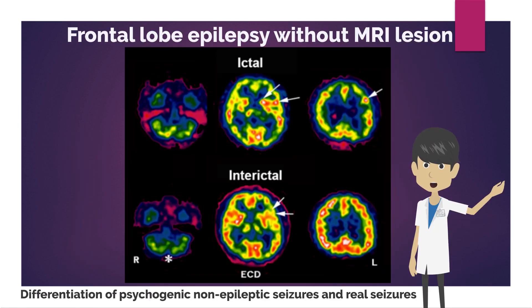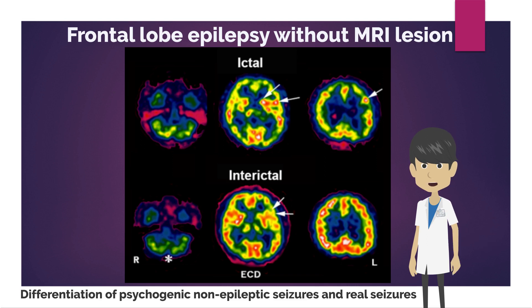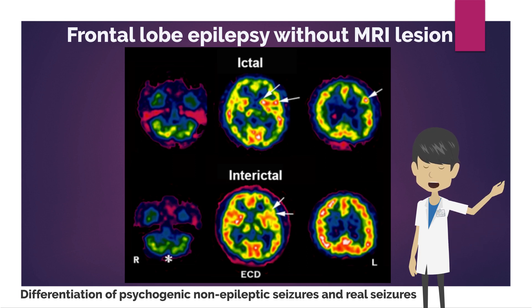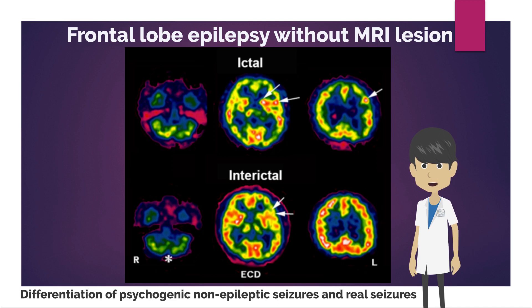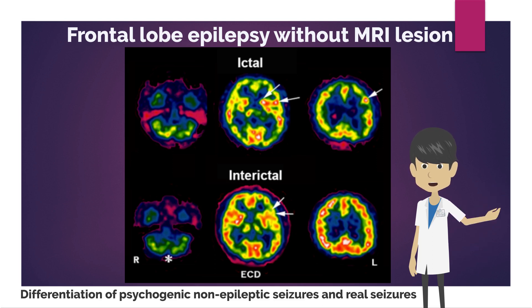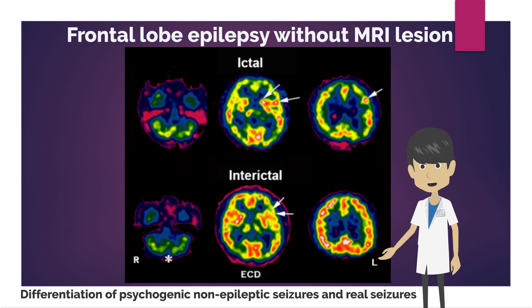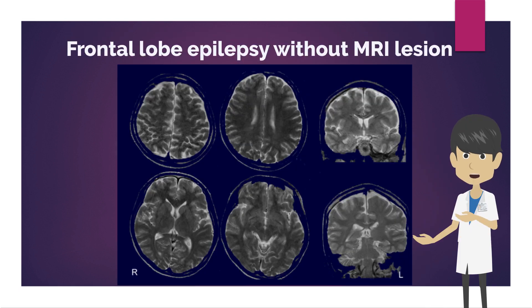Brain perfusion SPECT during interictal and ictal phases was obtained in a patient with frontal lobe epilepsy who did not show any findings on MRI. In this case, coarse motor movements of the arms and legs were observed during seizures, and psychogenic non-epileptic seizures were suspected. During the seizure, there is increased perfusion in the left frontal lobe and left basal ganglia. During the interictal phase, there was a mild decrease in perfusion in the same area, confirming real epileptic seizures.